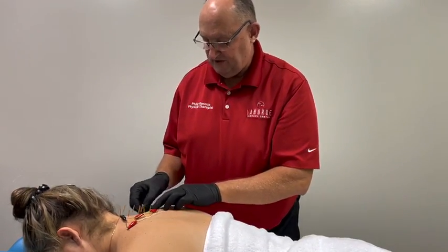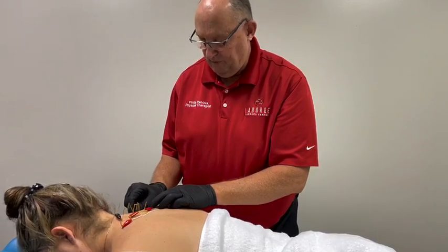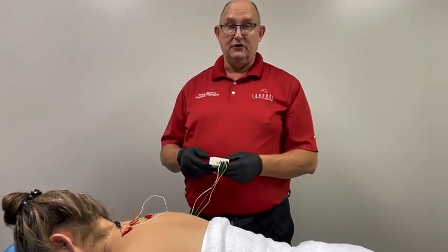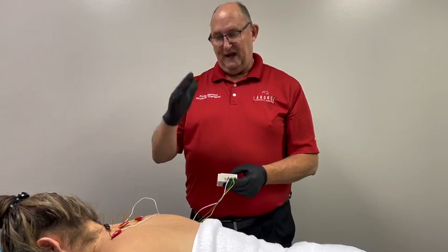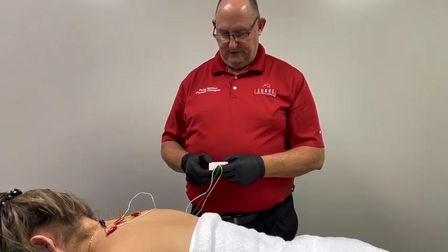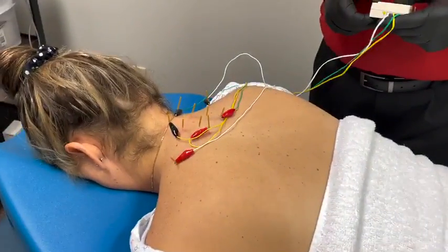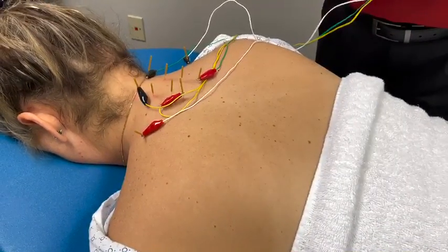And you want to take as much stimulation as you can take, almost to the nauseating part, just so you can get a benefit to have it the next day. And that's called De Qi. So De Qi is the Chinese name for pain before, to not have pain after. So I'm going to turn this up, and you're going to see on her upper traps how it kind of makes her twitch, makes the muscle twitch when it gets up there.